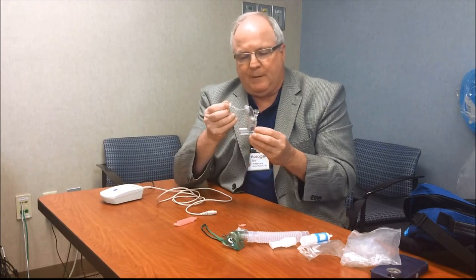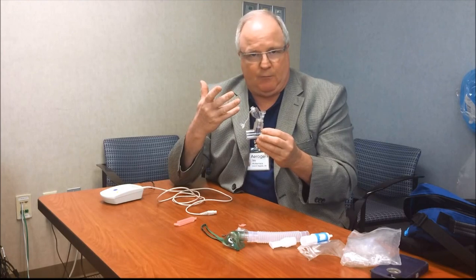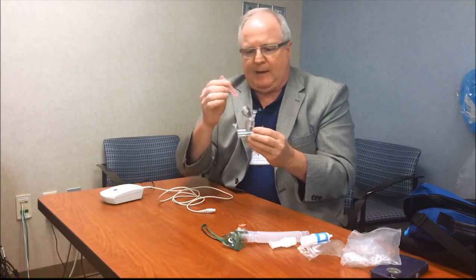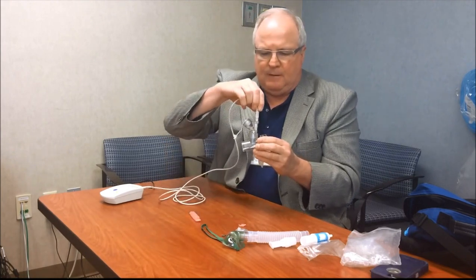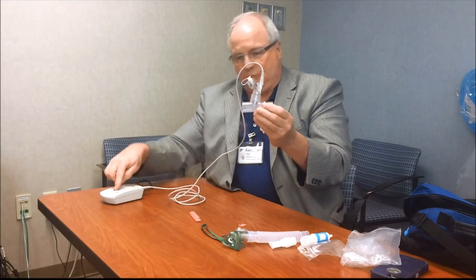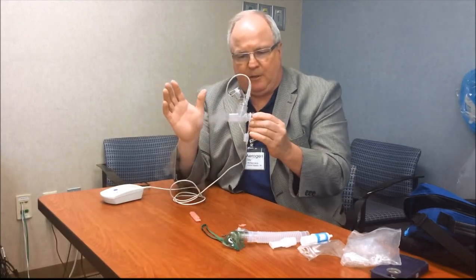When you do open the silicone plug to drop your medication in, you will not lose any airway pressure or gas. So basically what you would do is, once in the circuit, and I'm assured my ideal angle, I drop my medication in. Most probably you'll already have this plugged in. And then basically you would just turn the device on and make sure that you recognize there is aerosol production.